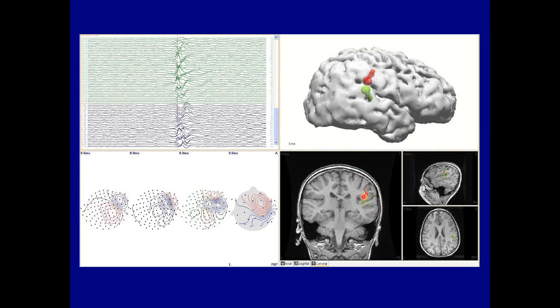Well, obviously, the earlier activity must be coming from this inferior frontal operculum cortex, and then what's happening is probably spreading out here into the lateral convexity cortex when the EEG is seeing it. So this EEG dipole is deep, but the cortex it's modeling is out here. So we're talking propagation from deeper in the sylvian fissure around the lateral side. Yes, this is a patient with Landau-Kleffner syndrome.